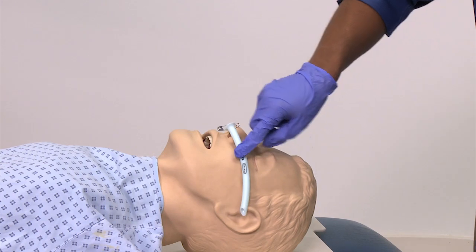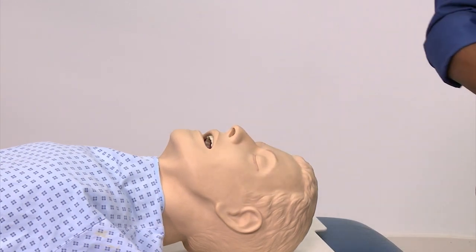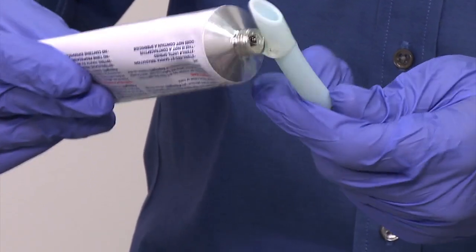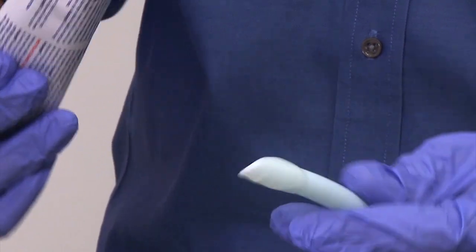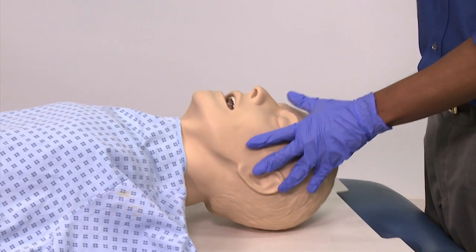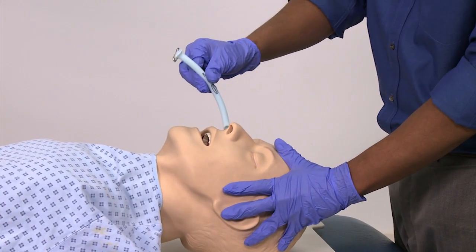Before insertion, apply a water-based lubricating gel onto the nasopharyngeal adjunct. Approach the patient's head from behind the bed. With the bevelled end, insert the airway through the most patent nostril.